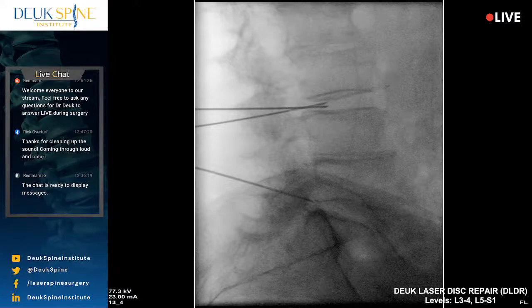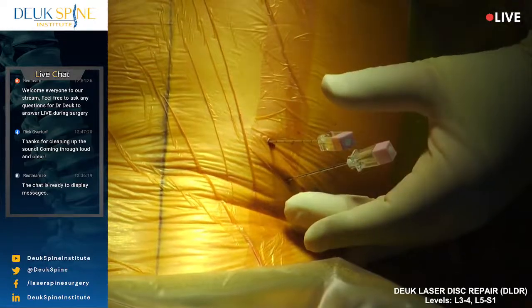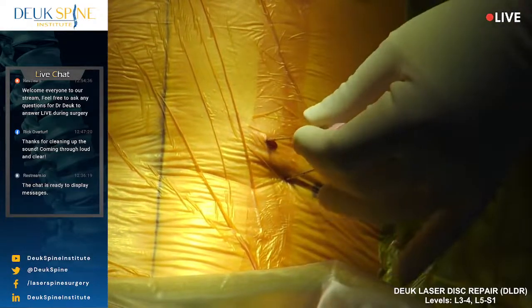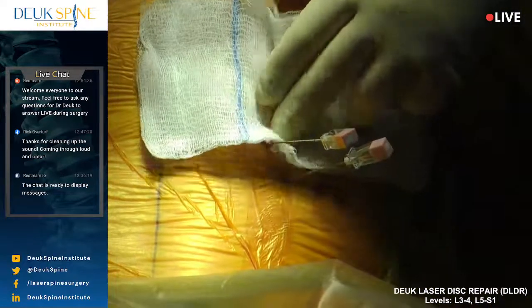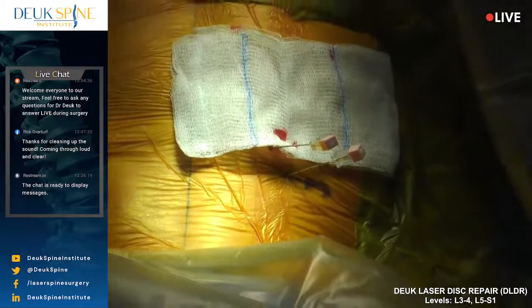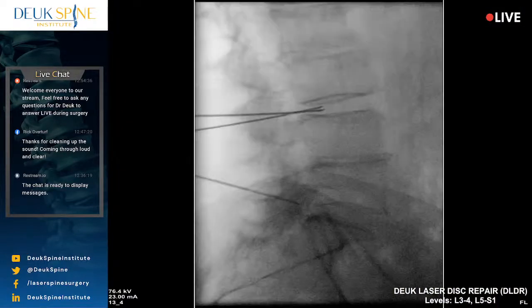You okay? Where do you feel that? All right. You said foot? Yeah. Just relax. Sean, is it better? All right, so she's more rotated. We're going to have to come in more lateral. You may actually be able to get it from that other one, from that incision. Let's try. Let me know if you feel any discomfort, okay?